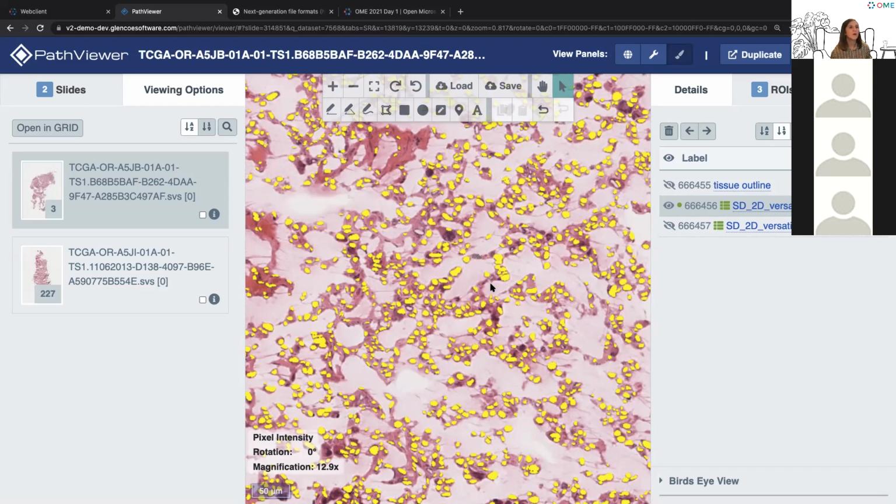Right now, this is just a series of arrays that represent the labels themselves, the objects themselves. But how do I represent the 100 measurements that I might have on this particular object, this particular nucleus?